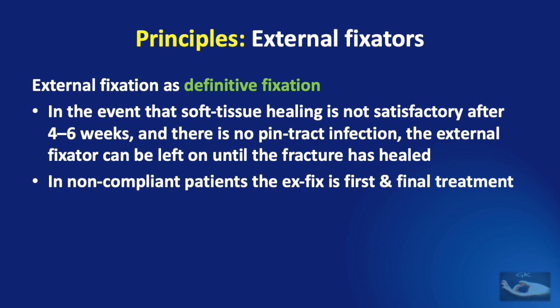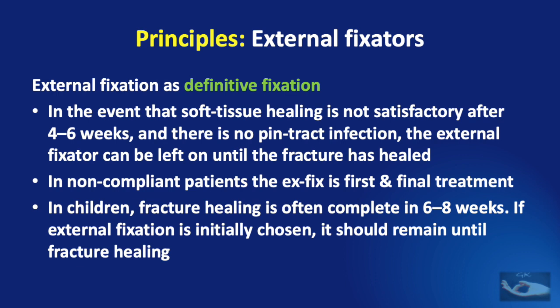In non-compliant patients, the external fixator is the first and final treatment. And in children, fracture healing is often complete by 6 to 8 weeks. If external fixation is initially chosen, it should remain until complete fracture healing.